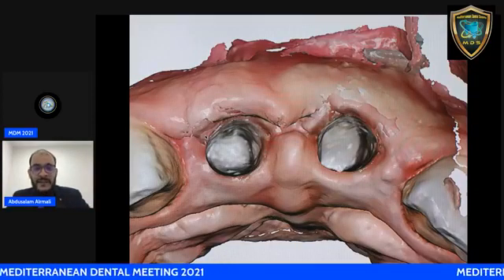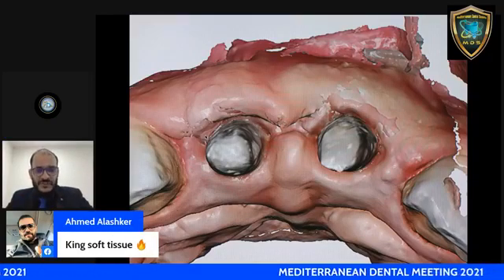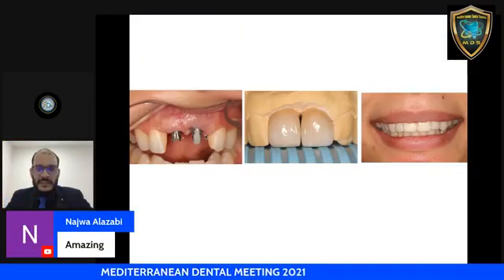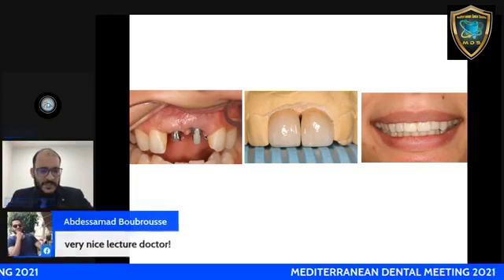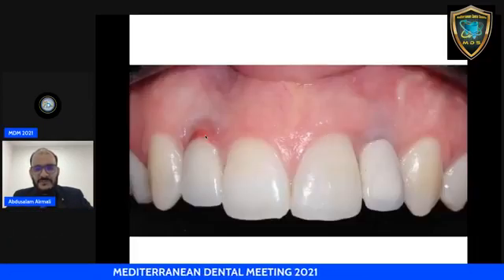Dr. Khairi Al-Azraq, he's my friend, a prosthodontist working with me in Abdusalam Center in Tripoli. He did the prosthetic part, did the intraoral scan. He delivered 2 crowns from Al-Khduri lab. Technician Abdullah Al-Khduri is also working with us in Abdusalam Center.